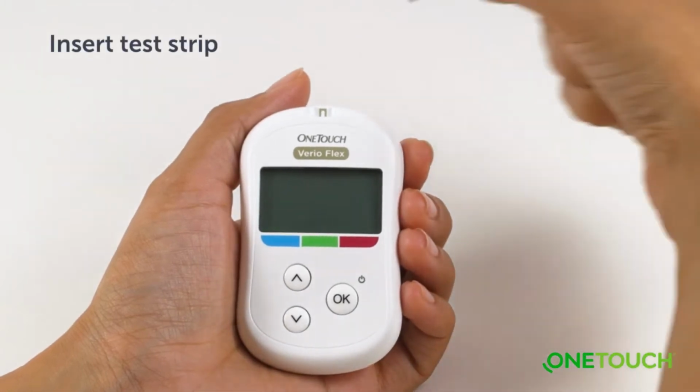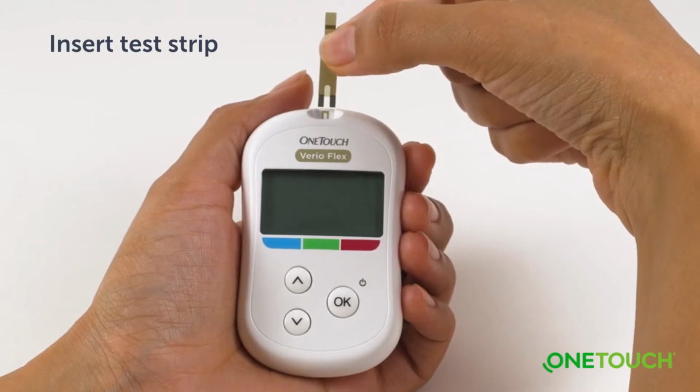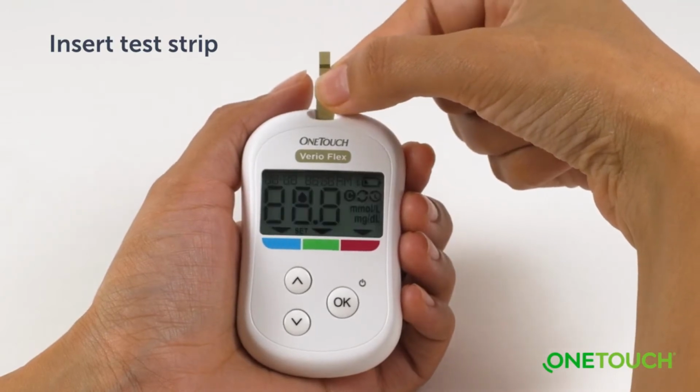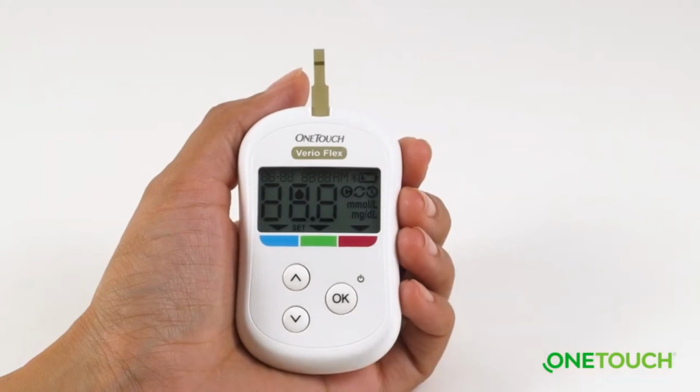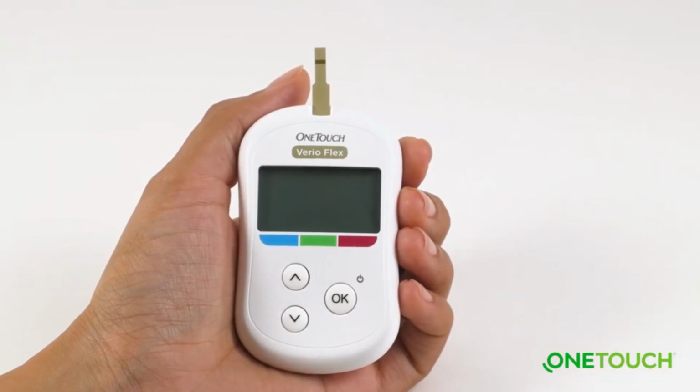Now we can prepare the meter for testing. Take one of your OneTouch Verio test strips and insert it into the meter's test strip port, making sure that the gold side of the test strip and two silver prongs are facing you. When you see the flashing blood drop icon appear, it's time to apply your blood sample to the test strip.